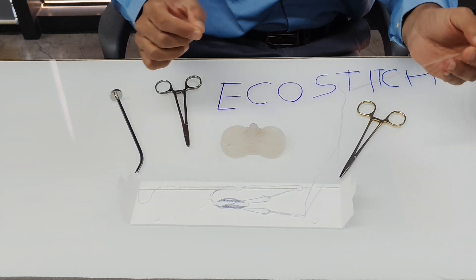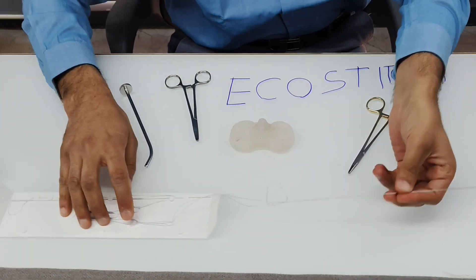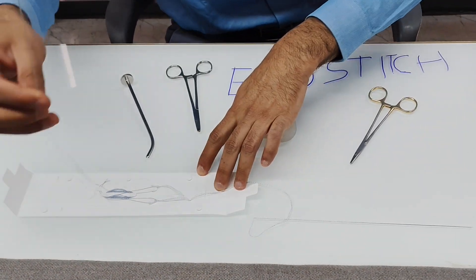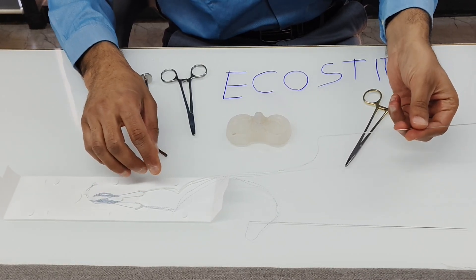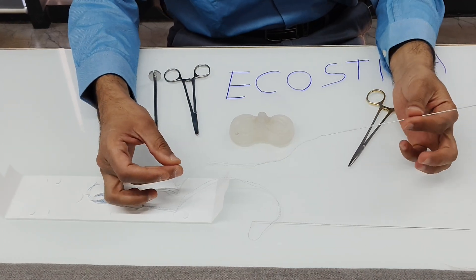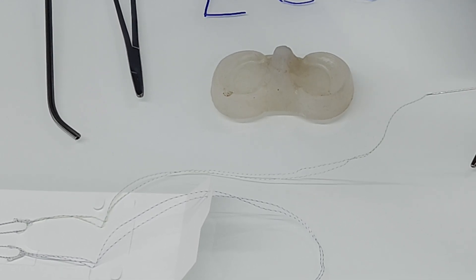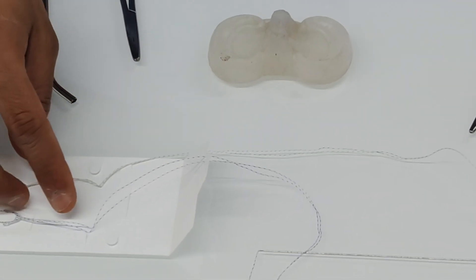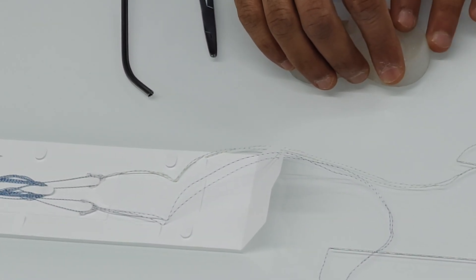This is the first needle, loaded with the anchor. This is the second needle, also loaded with an anchor. The thread attached to this needle is just a delivery device — once you pass this needle outside the skin, you cut it off and remove it. The anchor will then load onto the posterior aspect of the meniscus.